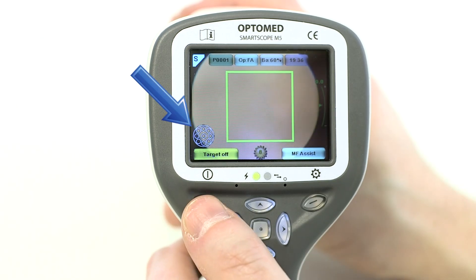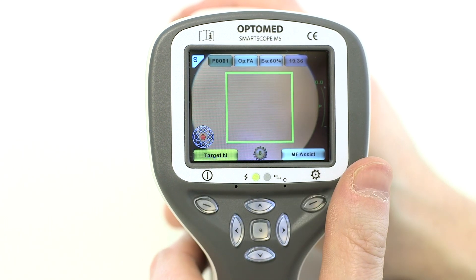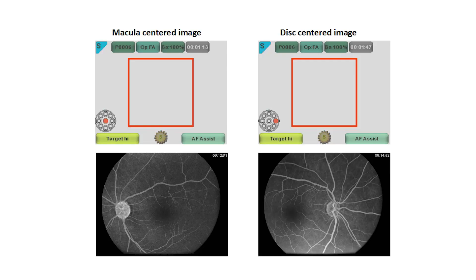Activate the internal target by pressing the left soft key. Move the target by using the arrow keys. To achieve a macula-centered image, select the middle target. To achieve a disk-centered image, select either the right or left target depending on which eye is being imaged.